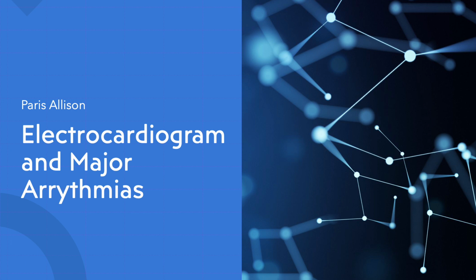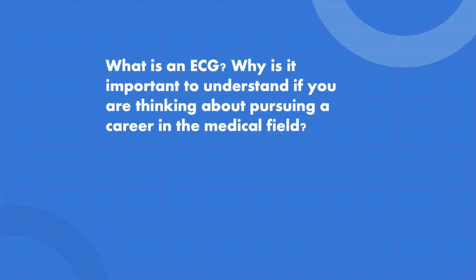Hello everyone. Today I'll be discussing the electrocardiogram, ECG or EKG, its key waves, their clinical significance, and the major arrhythmias that can be identified with this tool. What is an ECG? Why is it important to understand if you're thinking about pursuing a career in the medical field? Well, an ECG is a graphical representation of the heart's electrical activity. It is essential for diagnosing and monitoring heart conditions, helping clinicians evaluate the rhythm and health of the heart.